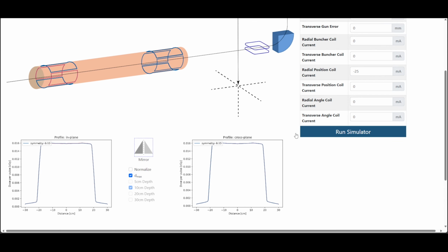Let's run a simulation and see what it gives us. Almost. How about -22 mA? Nice, a perfectly symmetrical profile. Similarly, cross-plane profiles are affected by the transverse coils.